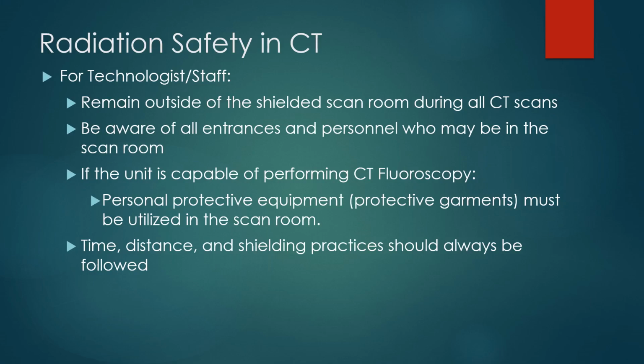Radiation safety in CT will be the responsibility of the technologist and the staff working in the scan room. Remain outside of the shielded room during all CT scans. Be aware of all entrances and personnel who may have entered the scan room to care for the patient or retrieve an item. If the unit is capable of CT fluoro, protective equipment must be utilized in the scan room. Principles of time, distance, and shielding must be practiced at all times.